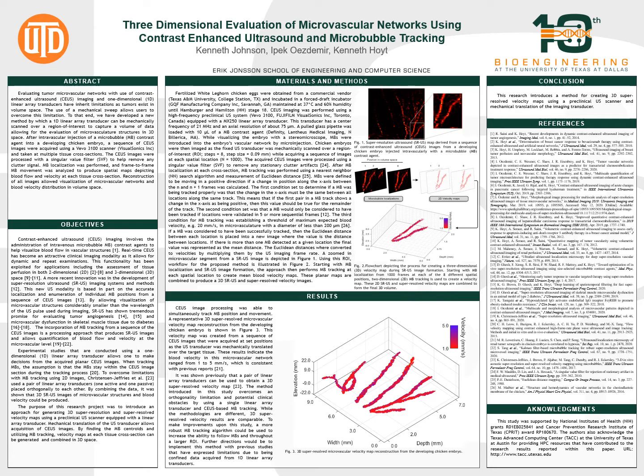This process is detailed in Figure 2 on the poster, and Figure 1 shows the region of interest from the original image. The results are a representative 3D super-resolved microvascular velocity map reconstruction from the developing chicken embryo, shown in Figure 3, created from a sequence of contrast-enhanced ultrasound imaging.